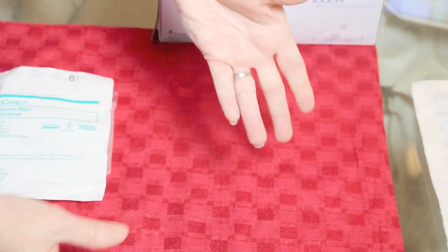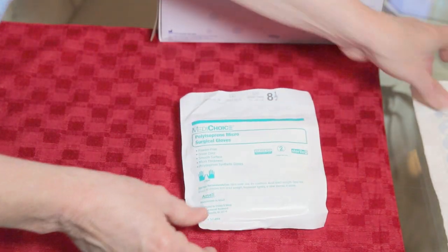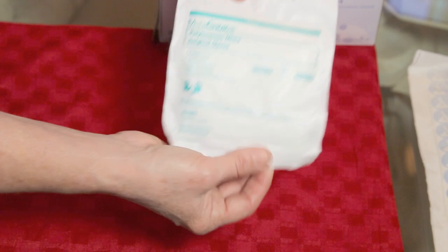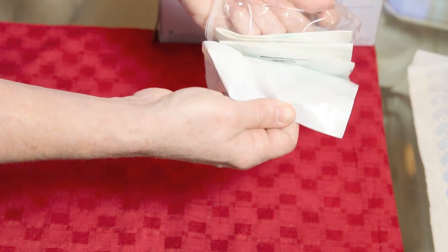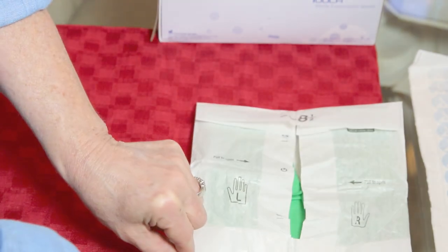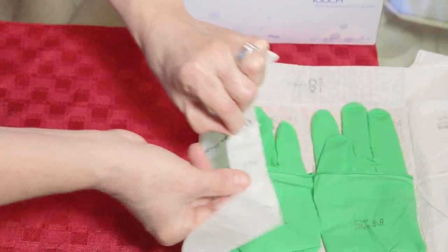Now for sterile gloves, which come in packages with a fold at the top that you unfold to open. The way to open them is to start from the top — do not put your fingers on the inside of the package. Open it up and drop it onto your sterile field without touching anything, then discard the outer package. Without touching anything but the outside corners of the inner package, unfold and open it up like a book, again not touching the gloves directly.